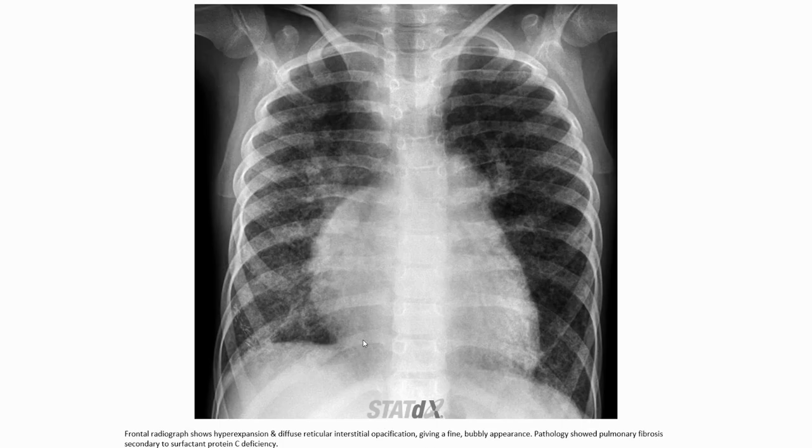Another case, a frontal radiograph, shows hyperexpansion and diffuse reticular interstitial opacification giving a fine bubbly appearance. Pathology showed pulmonary fibrosis secondary to surfactant protein C deficiency.